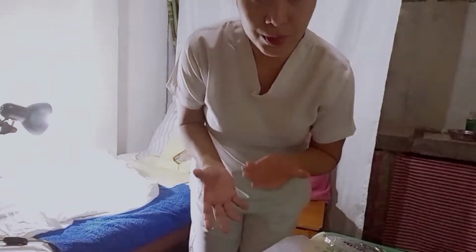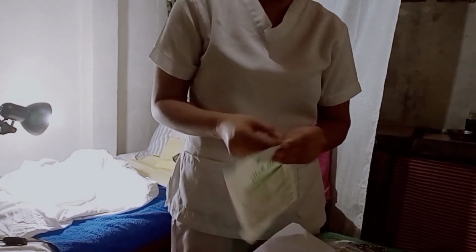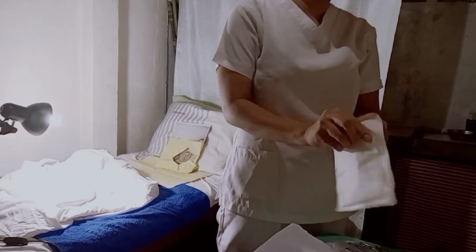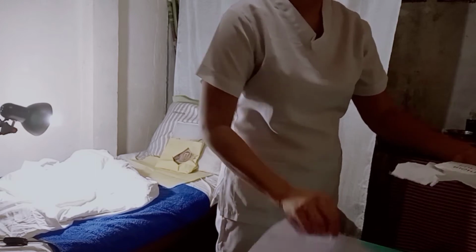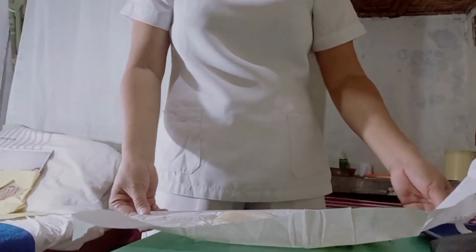So put on gloves first before that. Putting on gloves avoids contaminating other items in the kit.